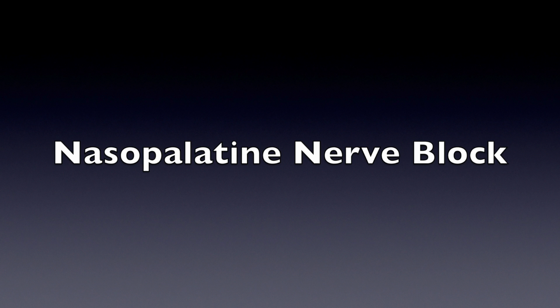The medical history has been reviewed and there are no changes. The vital signs are within normal limits. There are no contraindications for local anesthesia. I will be utilizing 20% benzocaine topical for 1 to 2 minutes. 3% mepivacaine plain local anesthetic with an expiration date of January 2019. I will also be utilizing a 27 gauge short needle.